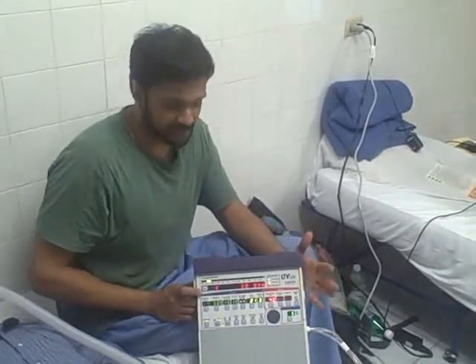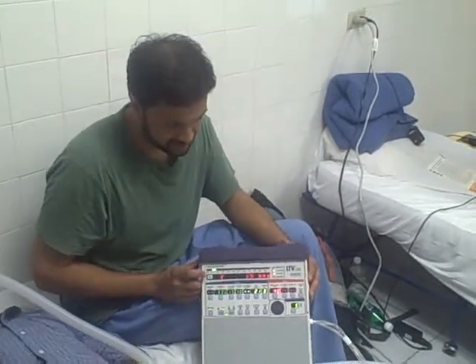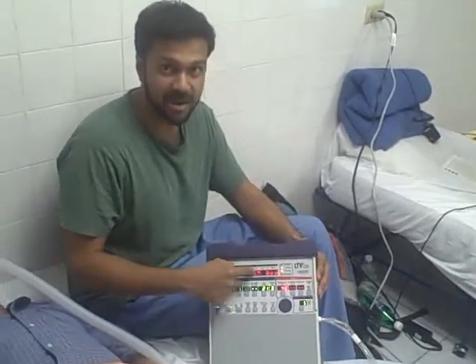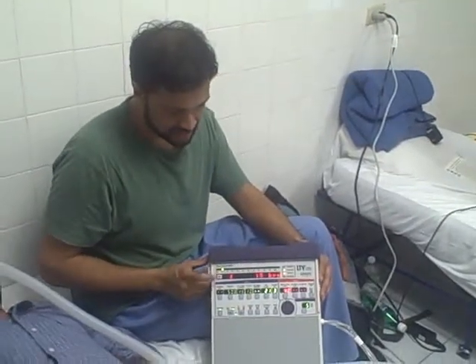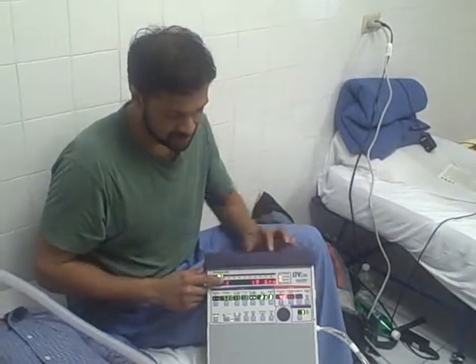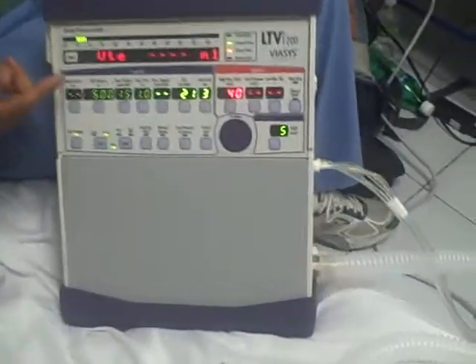The next stage of the ventilator is to start troubleshooting and to try to understand what's happening on the ventilator. One of the main functions of the vent is you can start to look at the parameters of what the patient is doing by hitting the select button. As you can see from the dialog box, the respiratory rate is 15. If you hit select again, it will continue to cycle through.